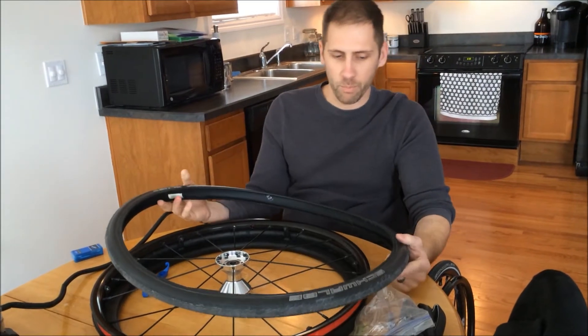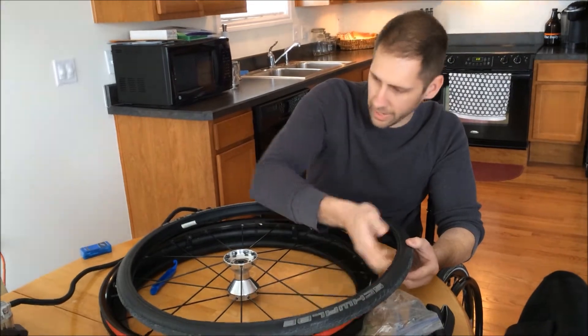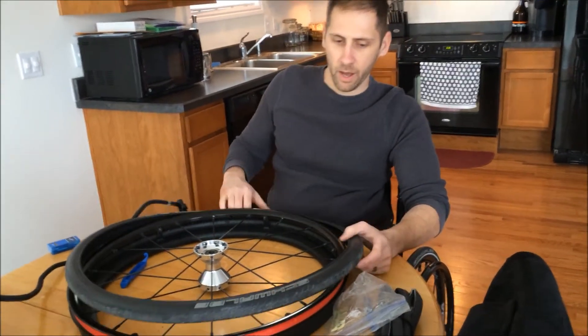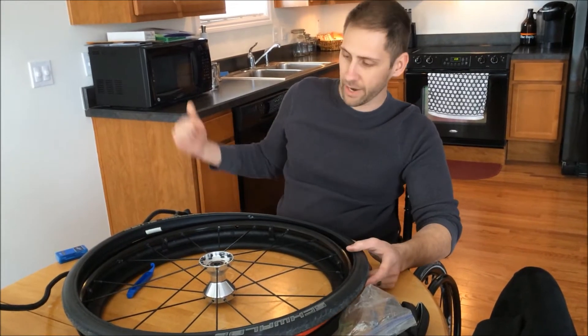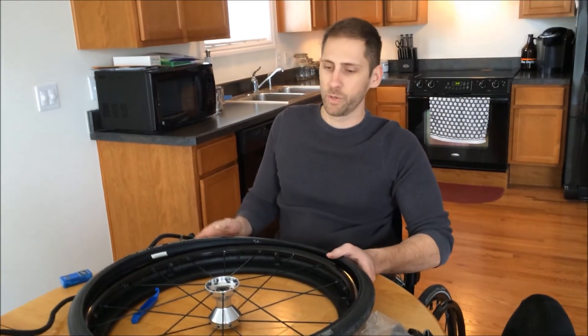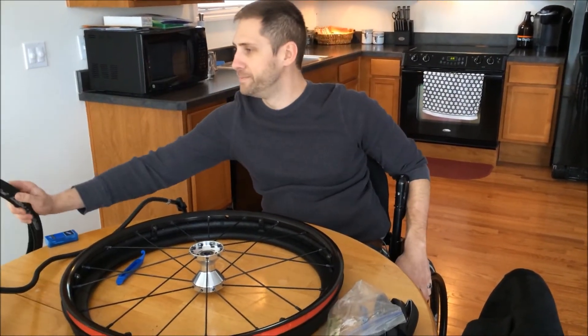At this point, if you were fixing a flat, you would just want to feel around on the inside of the tire to see if you've got a little piece of metal sticking through. If it's something that just went in the tire and came right back out, obviously there's not going to be anything there. But you definitely want to check that before you go and waste your money puncturing a new inner tube.